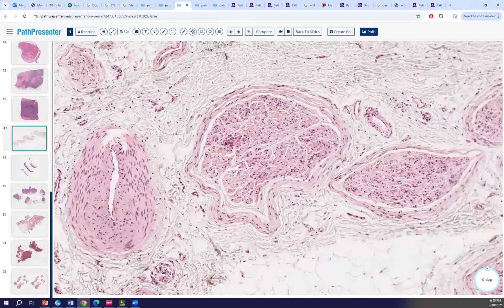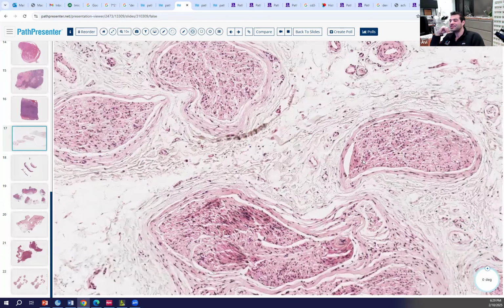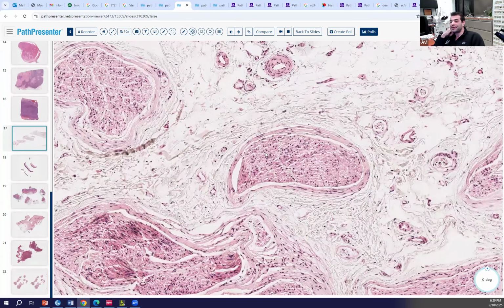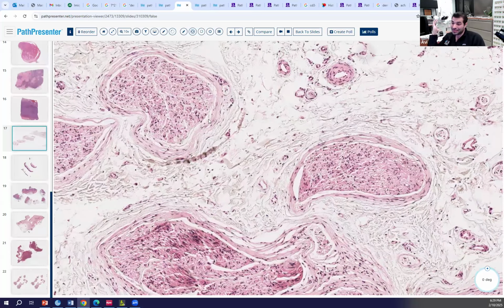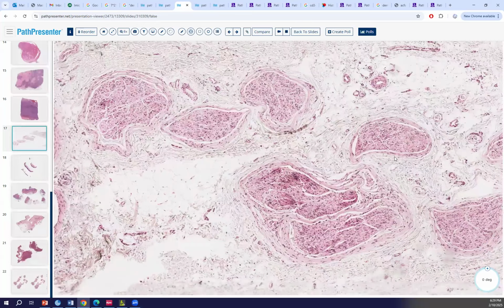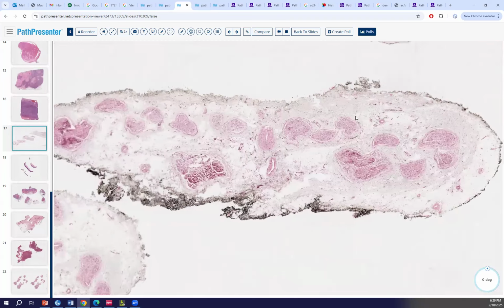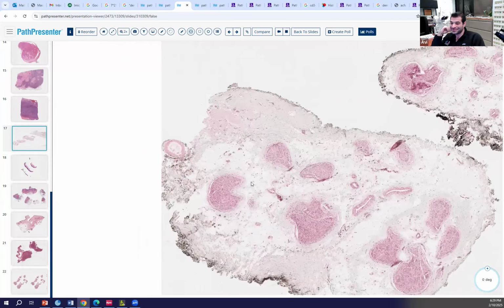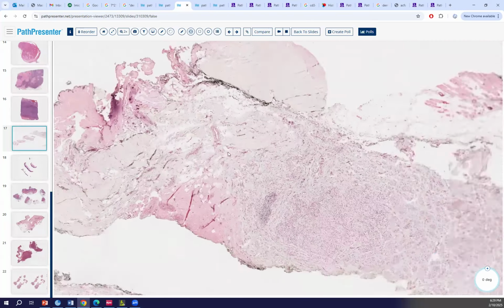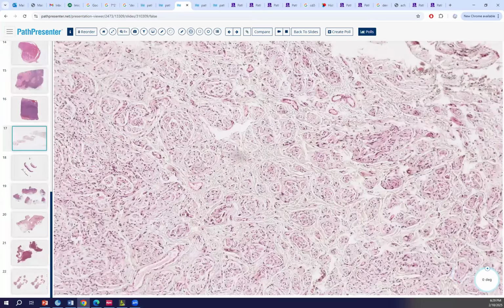Yeah, but this is the pattern you'd look for. But there's not much of an organization to it, in terms of like in real nerves, they're innervating something. Usually the nerves in traumatic neuromas are much smaller, like haphazardly oriented nerve bundles. This is large. I don't know what it's labeled, but that looks a lot like what you can get in a Morton's neuroma, with perineurial fibrosis, and it's deep in the subcutis and the fat.